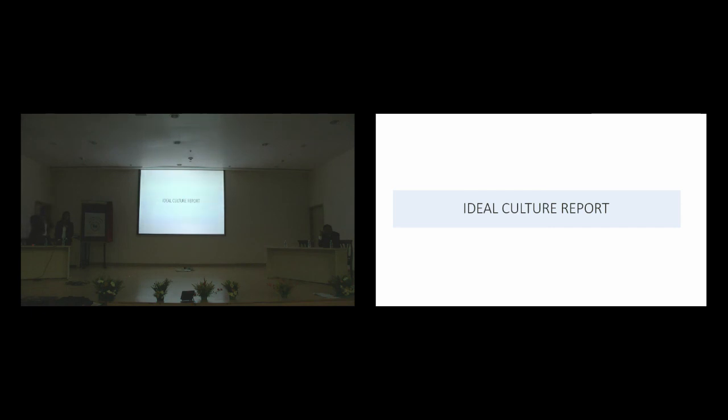But now as drug resistance is increasing and the breakpoints are shrinking, you have breakpoints as 1, 2 and 4, 0.5, 1 and 2. So the chances of very major errors are much, much higher. That's why in Vitek, previously the average number of wells for an antibiotic used to be 3 to 4, but now the average is about 4 to 6, and the majority would have about 4 wells minimum. And sometimes for vancomycin, there are about 7 wells.